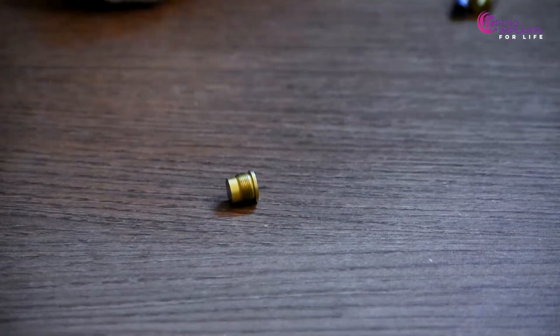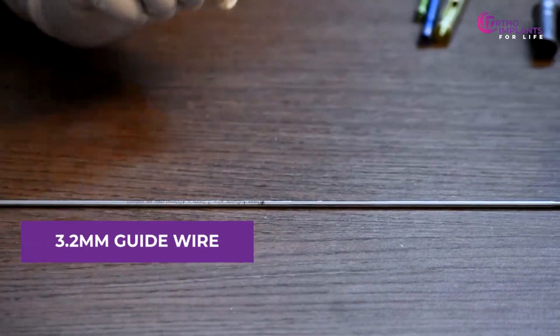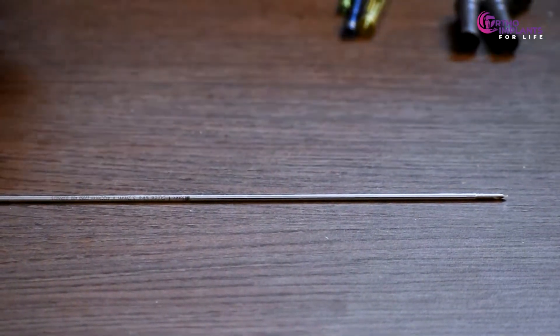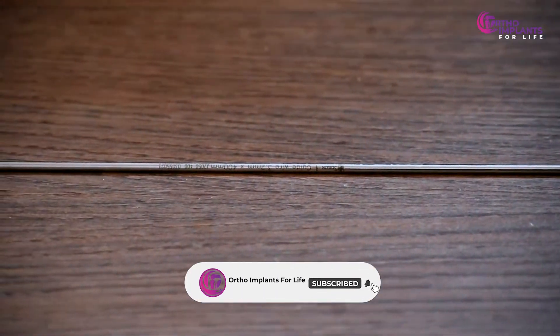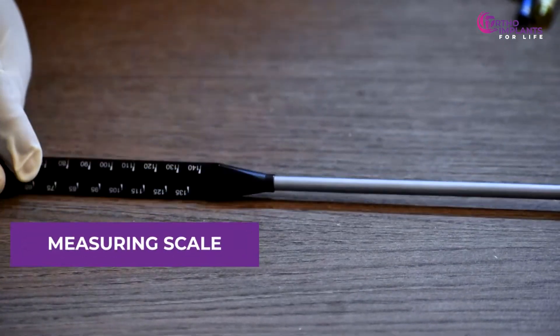Now let's move on to the instruments. First, we have the 3.2 millimeters guide wire. Next is the measuring scale.